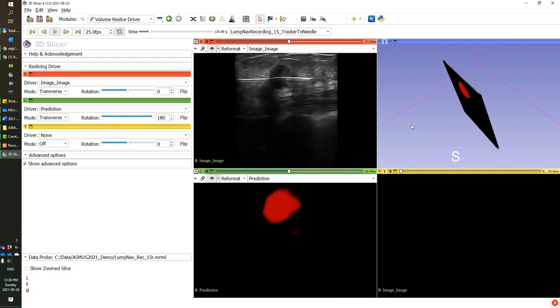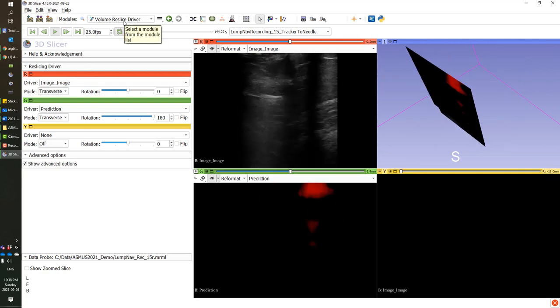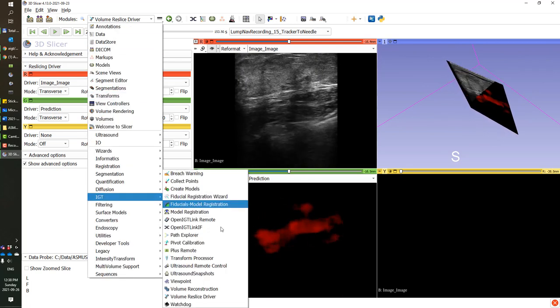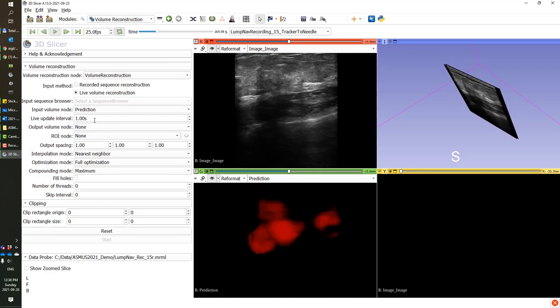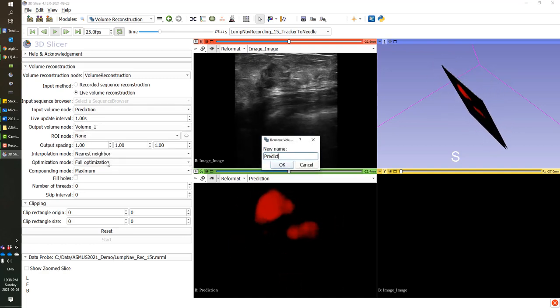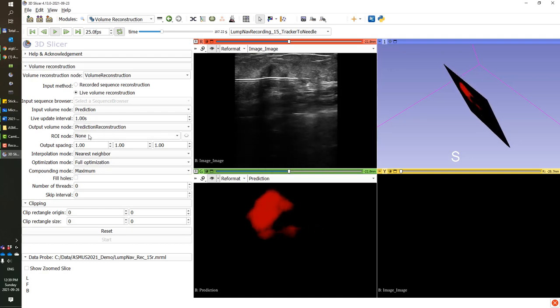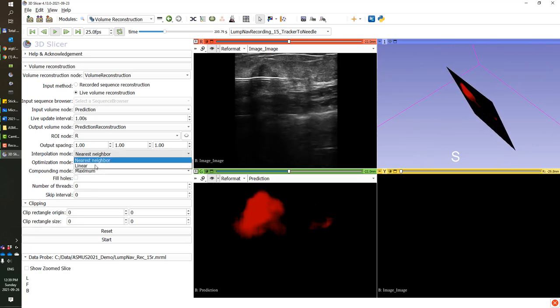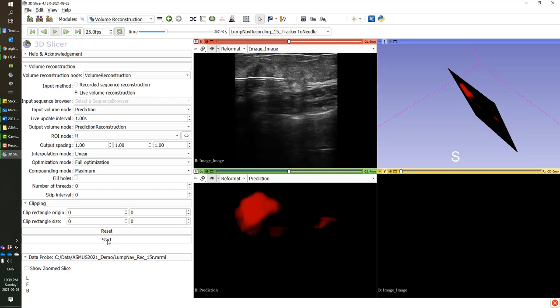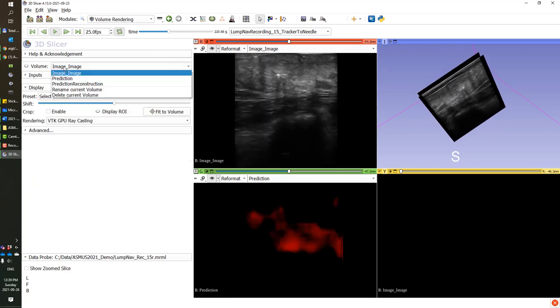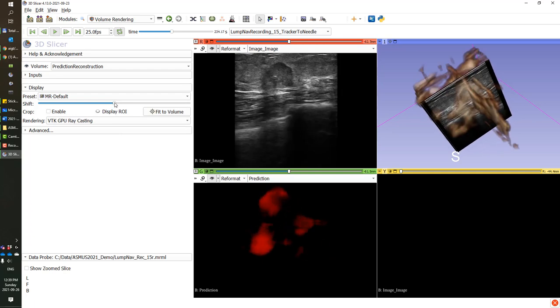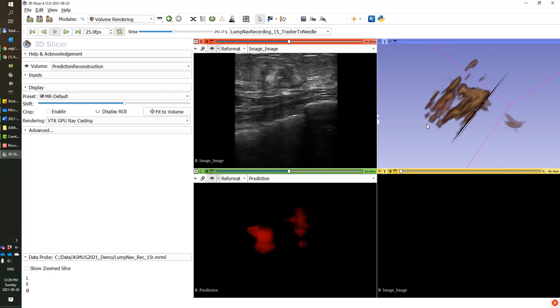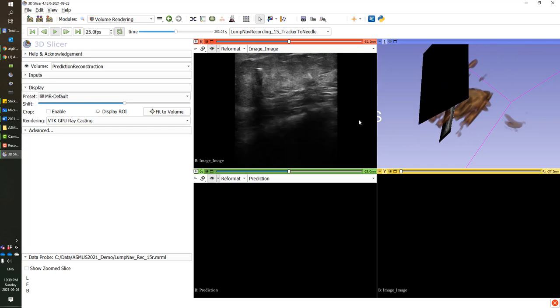As you can see in the 3D view, if you visualize in 3D both the ultrasound image and the prediction, the prediction sometimes lags behind the ultrasound image since it's generated on a separate process. But now we can apply live volume reconstruction on these prediction images. We will create a new volume for predictions, we'll call it prediction reconstruction. I've already created a region around the scan, so we will populate this new volume in that area. And now that we start volume reconstruction, it is already happening in the background. We just need to visualize it using volume rendering. The MRI preset is what usually I prefer for ultrasound images. And again, increase the visualization threshold so we only show the areas in 3D which are most likely to belong to tumor tissue.